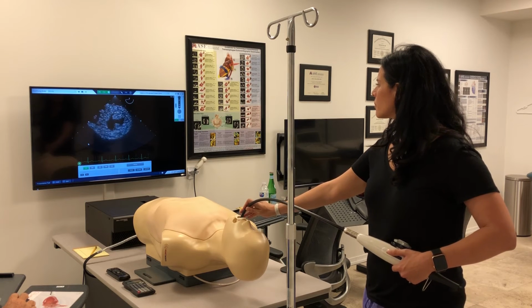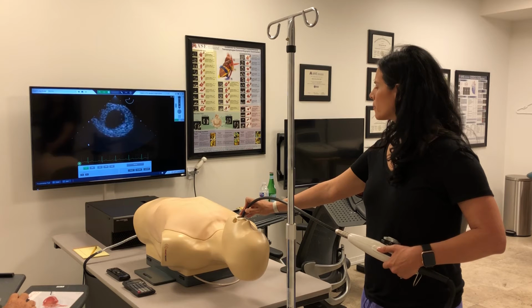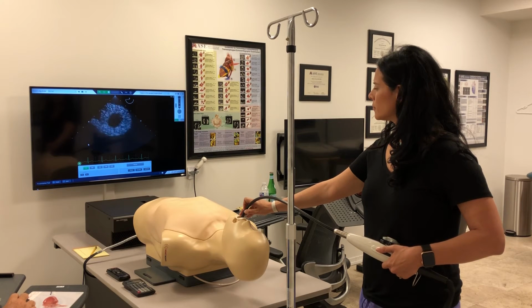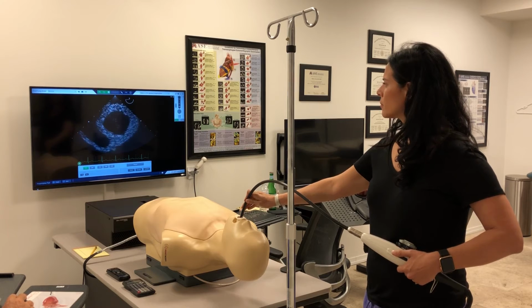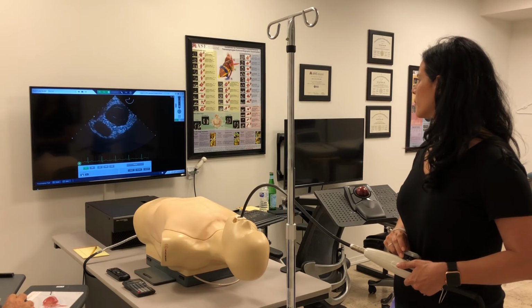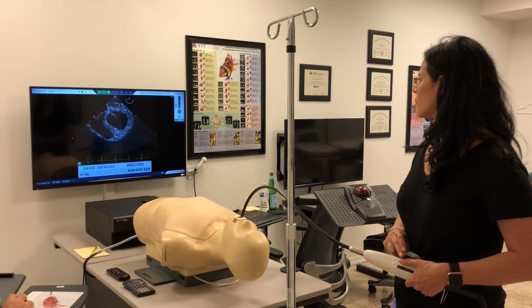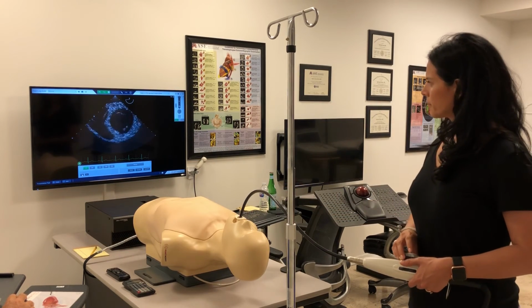It's simply pushing the probe in until the papillary muscles disappear. Good. Now we're at the apical short axis view. Full name is transgastric apical short axis view. Now let's withdraw back to the base to get the basal short axis view. And this might involve a little bit of anteflexion to define the tips of the mitral valve where it's coapting.